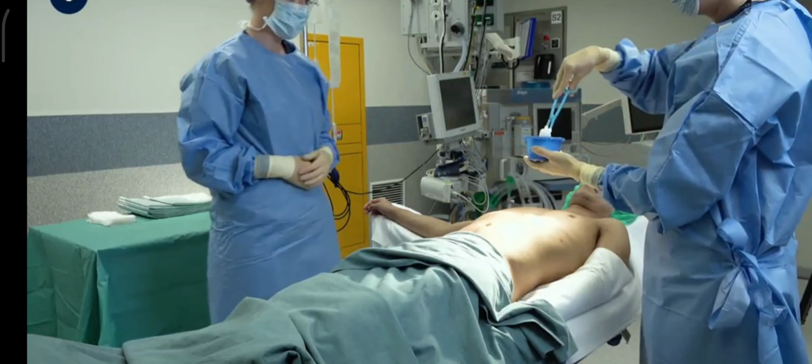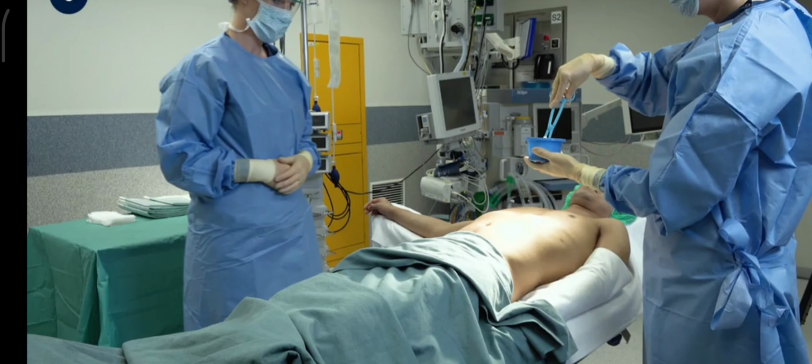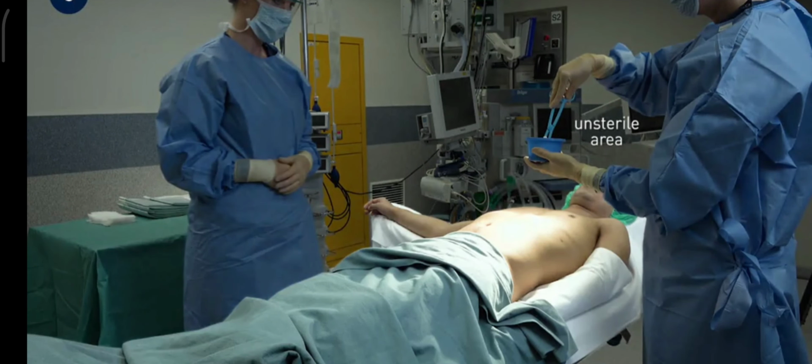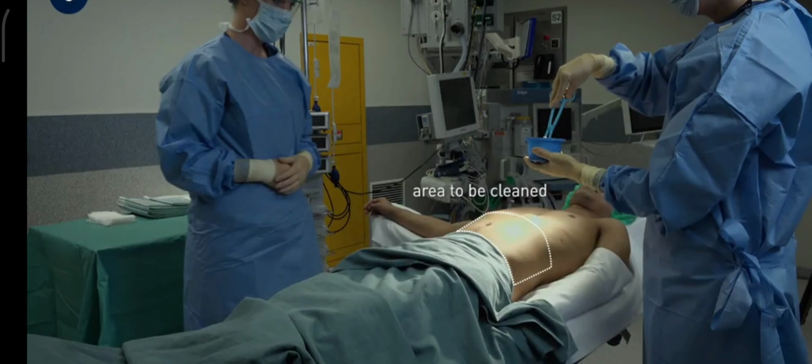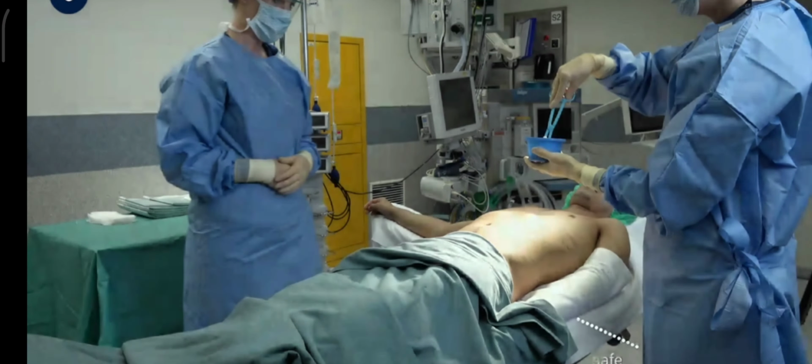Take note that positioned in this manner, both the patient and the surgical table are not sterile. The parts of the body that are not involved in the procedure remain covered to keep the patient warm and maintain their dignity. The exposed area to be cleaned should first be inspected for abnormalities, such as broken skin. Hair removal may be required. The sterile team members maintain a safe distance from the unsterile area.